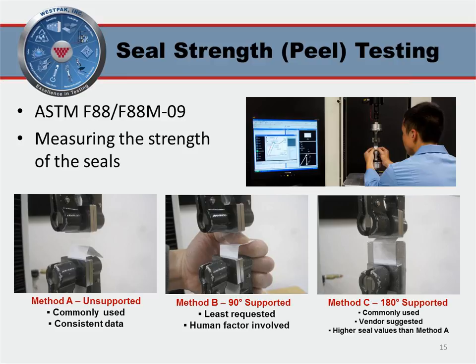We always get asked which method is better. Our advice is to just keep the test method consistent. That way, all your data would be comparable to your previous testing. Remember to check previous testing and ask your vendor which method they use for validating their seals.